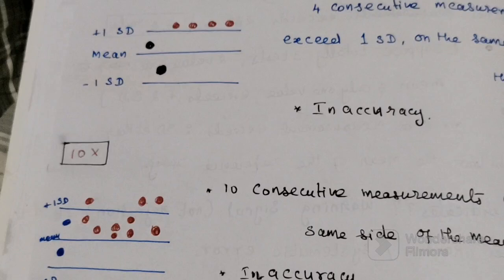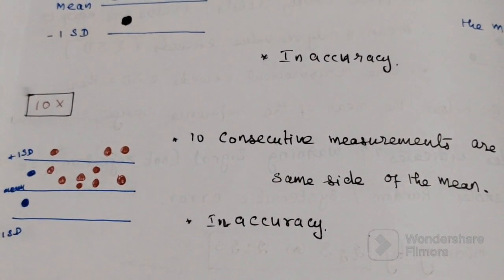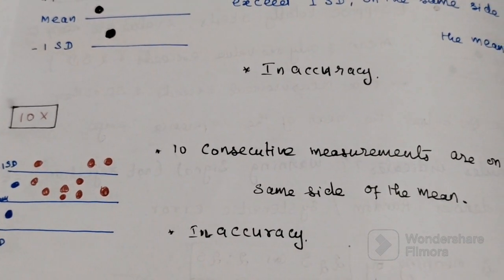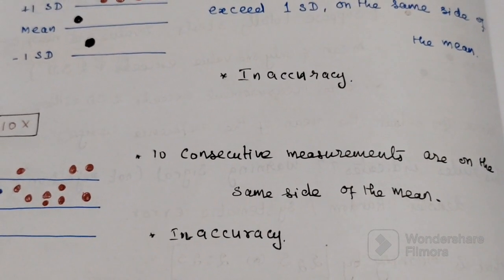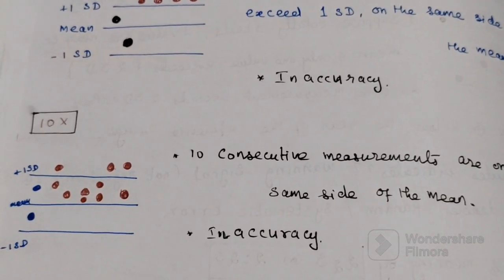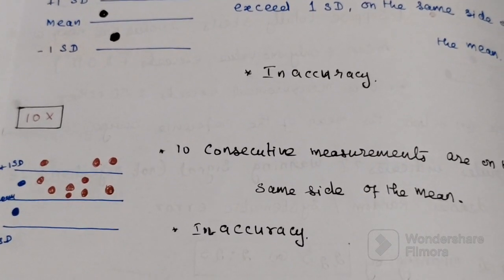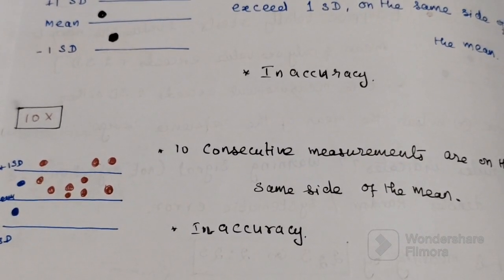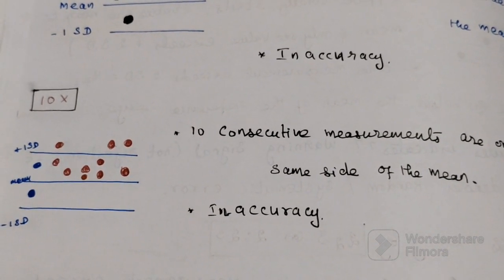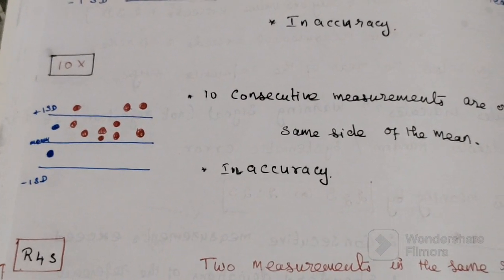Then what is the 10x rule? If you are running a normal control and for 10 consecutive days you are getting the data points on the same side of the mean, it is called the 10x rule within run. And if you are running two levels of control for 5 consecutive days, you are getting results on the same side of the mean, it is called the 10x rule across runs. It denotes a systematic error.